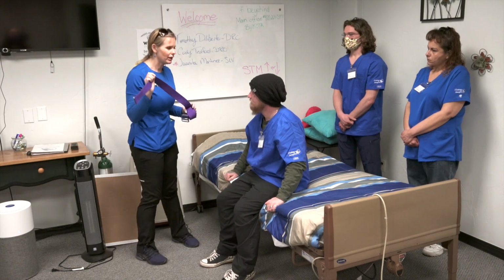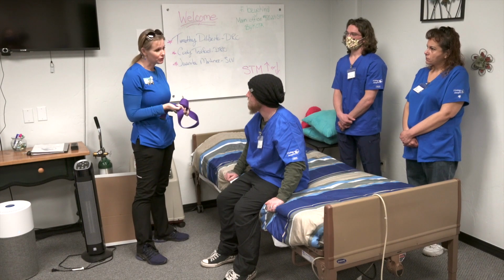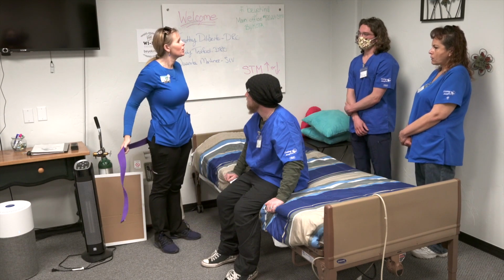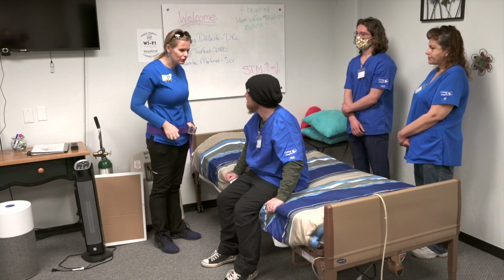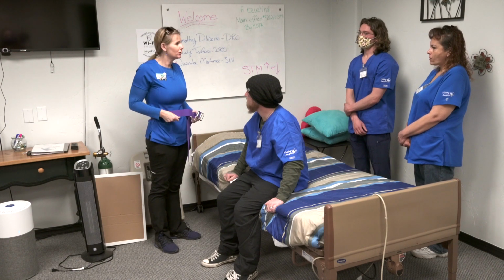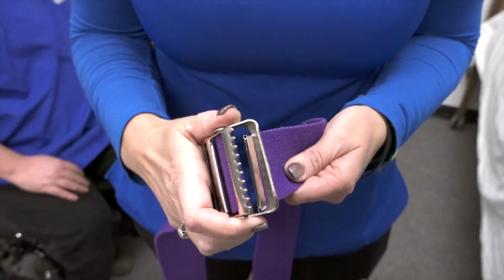We are going to use the gait belt. Now, not every client needs a gait belt. This is really up to your discretion. With gait belts, you want to put it around the smallest part of the waist. Men and women alike, it's going to be right underneath the breast. You don't want to put it on the hips because as soon as they stand up, they're going to get skinny and you're going to have a lot of extra, and the gait belt's not going to do you any good.